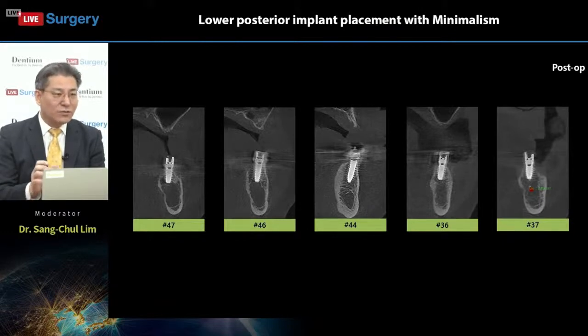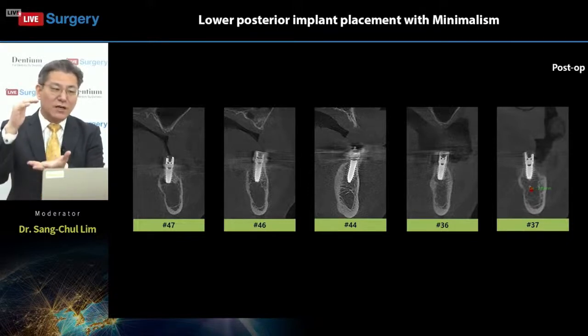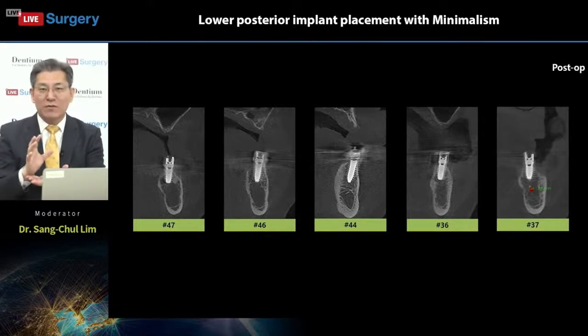Due to the close proximity of this inferior alveolar nerve, he decided on 5 millimeters, right? The inserted area into the alveolar bone is 5 millimeters, but the top portion is 2 millimeters with a polished surface, so the total length is 7 millimeters, with 5 millimeters inserted into the alveolar bone. There is another version, a 7 millimeter tissue level implant, but anyway, we can use 5 millimeter.